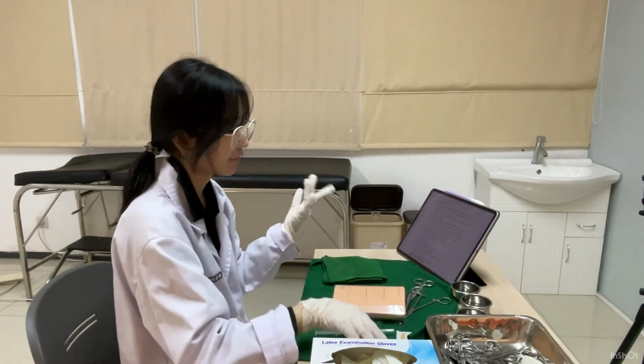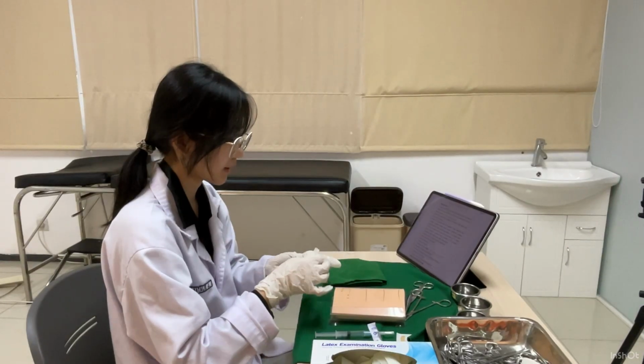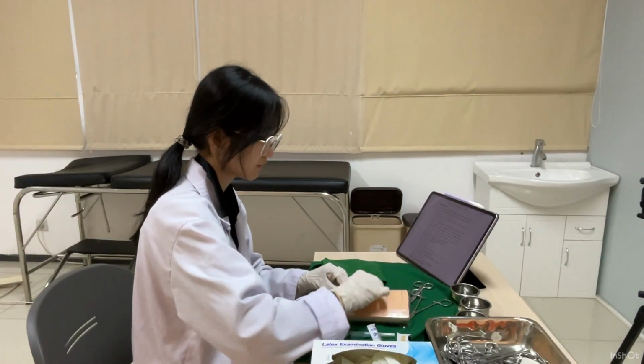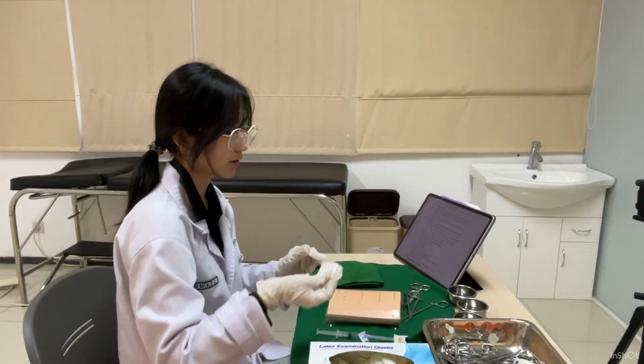Okay, next I will perform aseptic and antiseptic techniques, which is the alcohol swab. I will swab it from inner to outer in a circular motion. And then I will use another alcohol swab and swipe it in a vertical way following the wound.